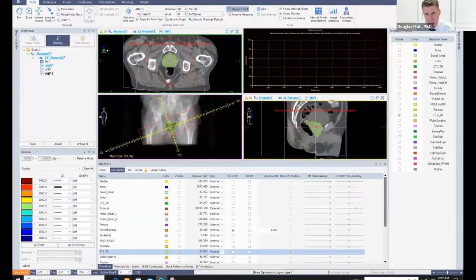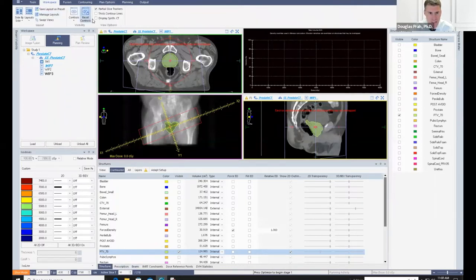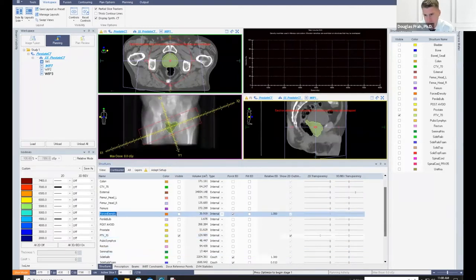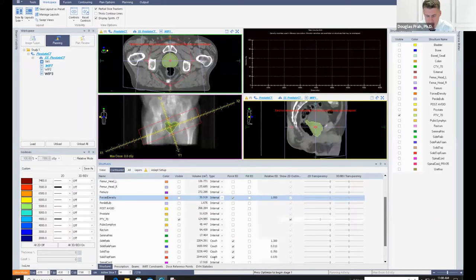If there's contrast agent, which you can see looks like there's some in the bowels here, then we take care of that. I do find it's very helpful to use the synthetic CT function to make sure that I'm forcing things properly. So you can see in here, we actually contour all density that needs to be forced, any contrast, and we call that force density. And then I assign that a value of 1. We do assign treatment couches. So we have a treatment couch library that we use, and we have all the components of that.